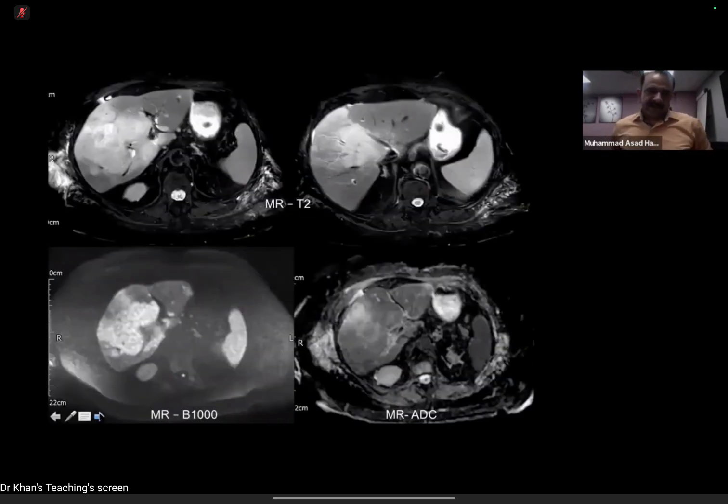We found this MRI afterwards, which is showing a sheet-like pattern. The only thing now to resolve the diagnosis was to perform a liver biopsy, which we have recommended previously, that if it is a new primary or metastasis, liver biopsy can settle the score as to which one is the diagnosis.